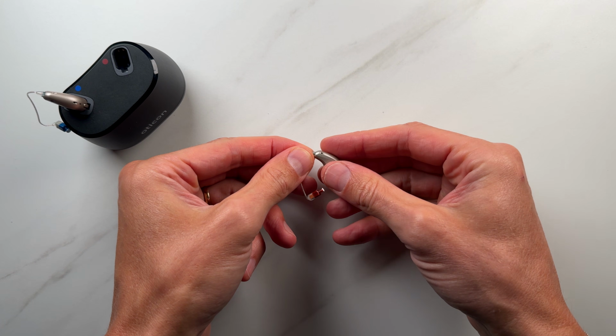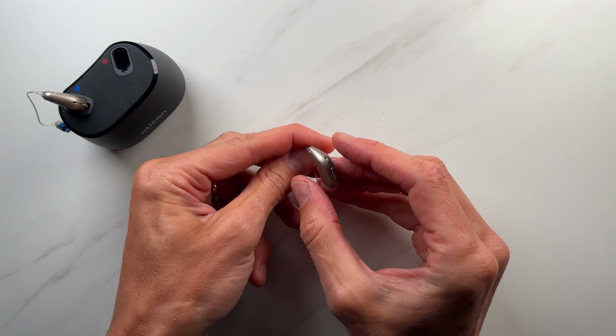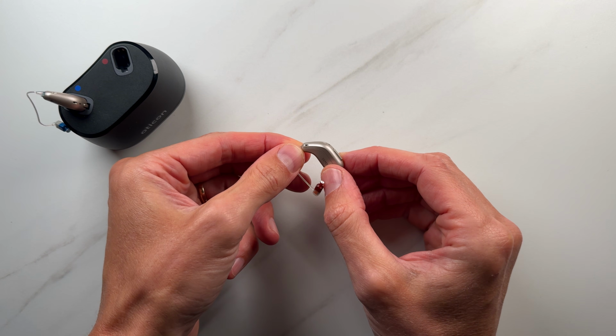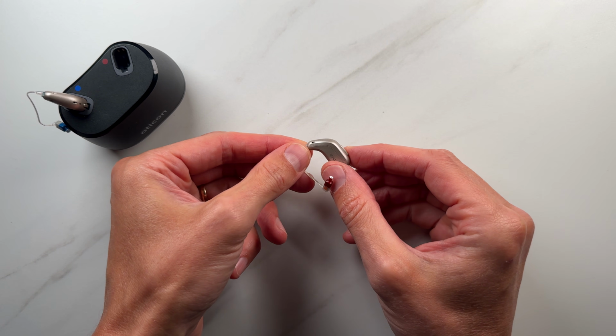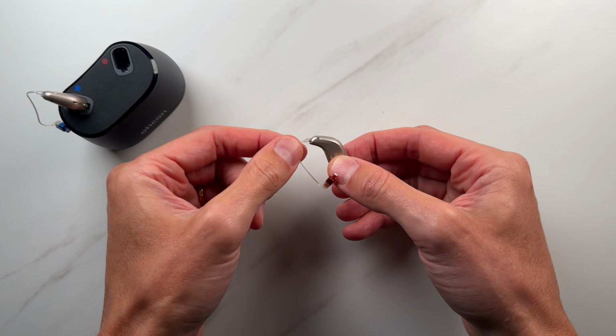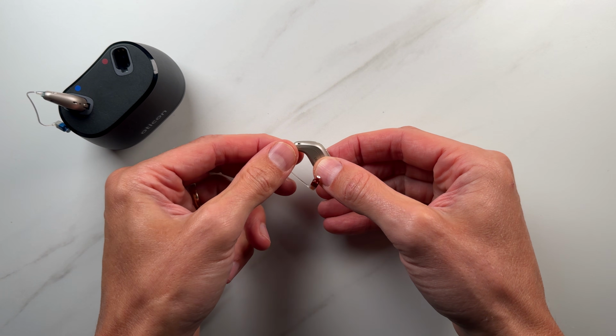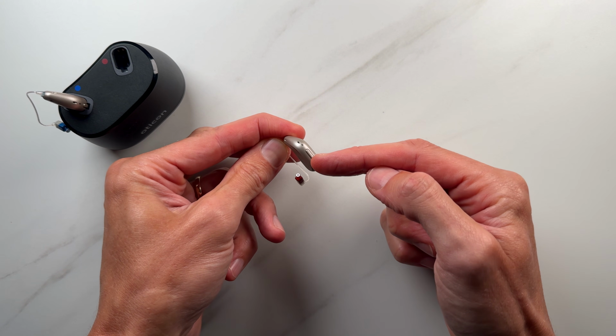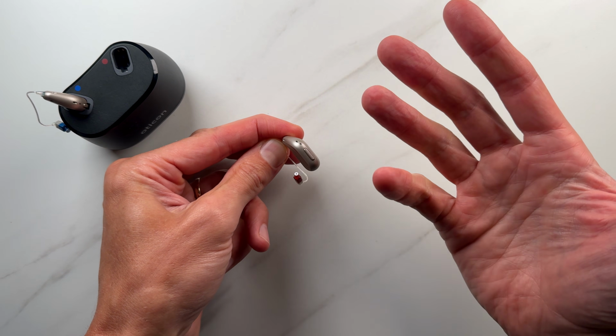The new design is shorter than their previous models, which my patients have welcomed when discretion is important. But at the same time, it's also a fraction bulkier, so I've had a few patients mention them clashing with their glasses. Oticon's redesign includes a slightly tweaked angle on the top, which I'm told is for better comfort and fit. In the redesign, Oticon have also removed the rocker switch that they had on the Oticon Real, which I've got to be honest, patients did like due to its flexibility.